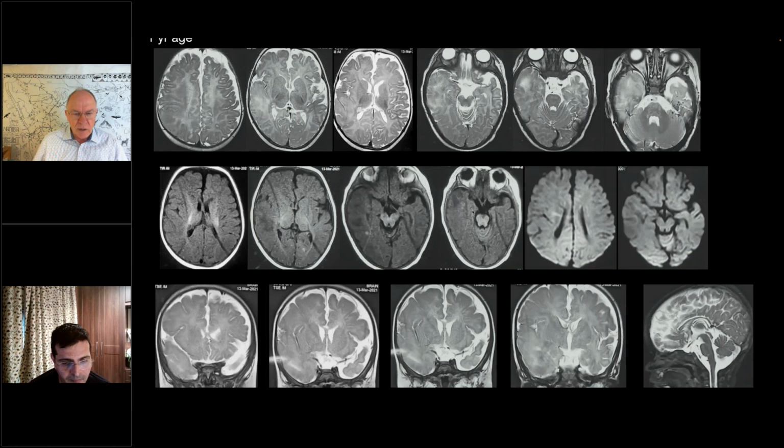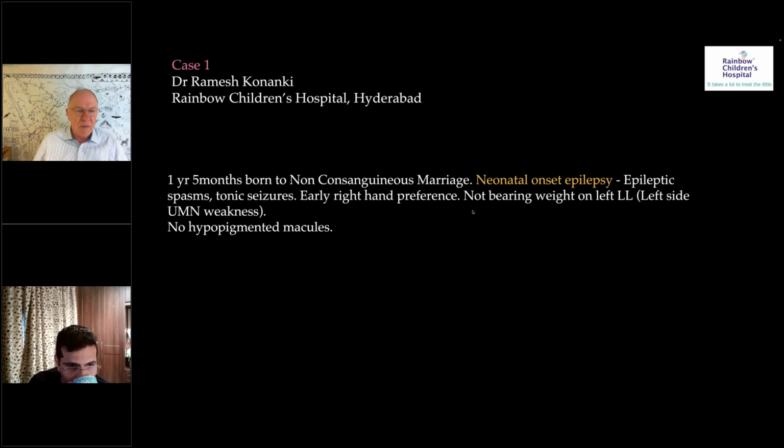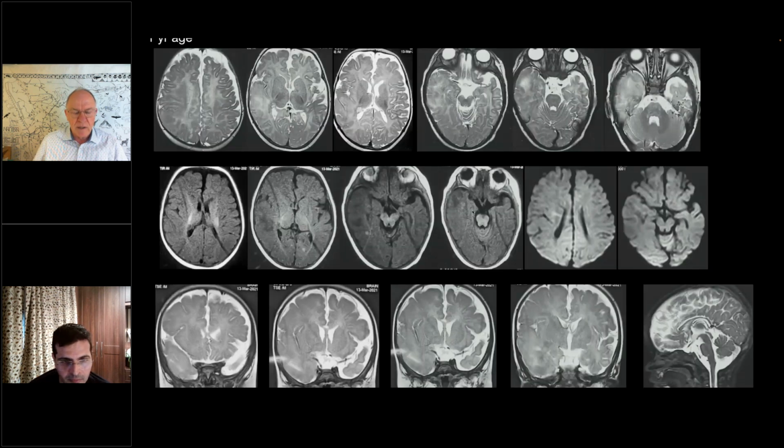I just wonder, would you, Nihaal, go as far as to suggest that this is tuberous sclerosis, or is this just an option among others explaining hemimegalencephaly? I would say option because it doesn't fit the criteria of tuberous sclerosis, at least imaging-wise, but I would say probably evaluate tuberous sclerosis as a possibility. With infantile spasms, I think that would be one of the definitions.